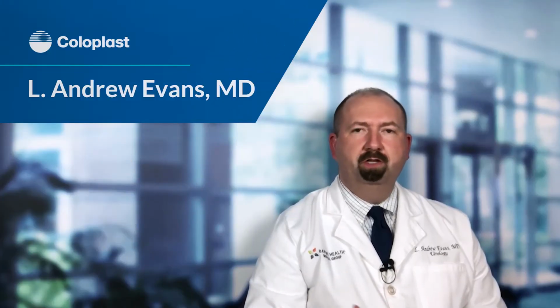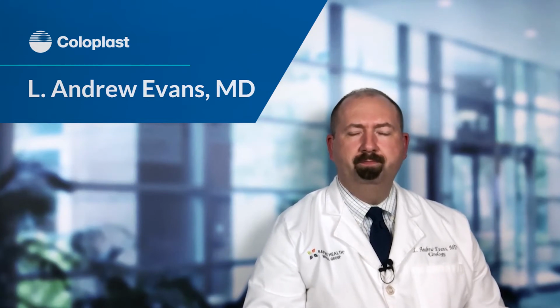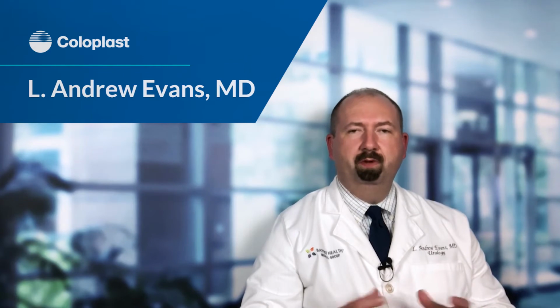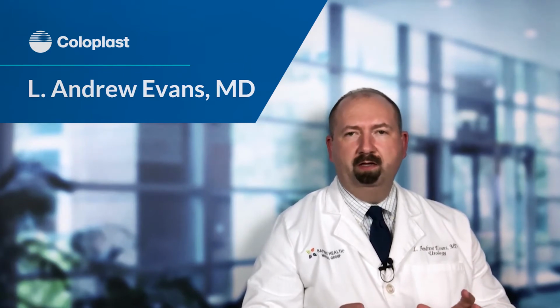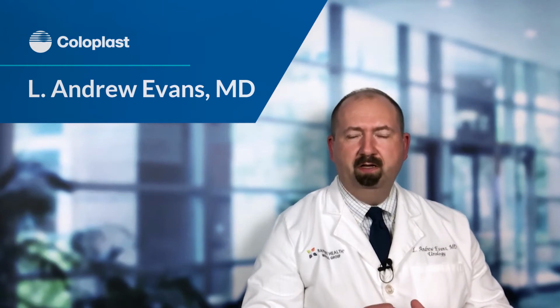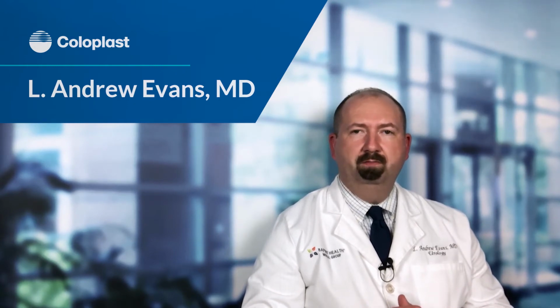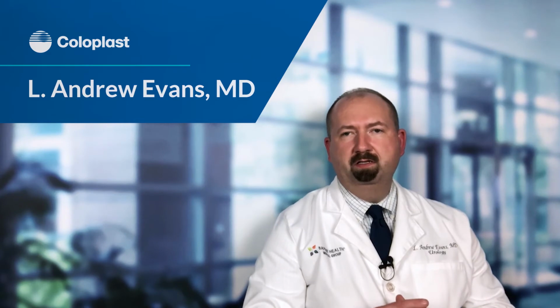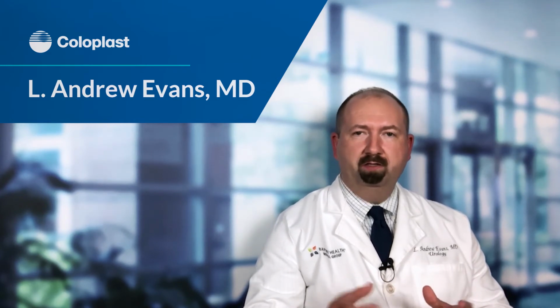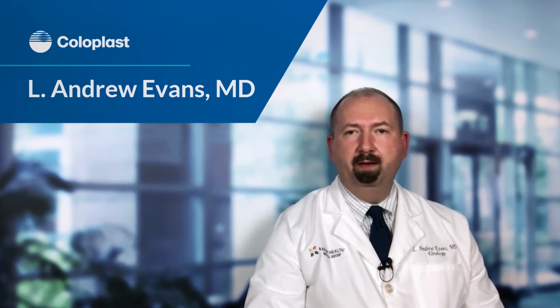All male slings are generally made of polypropylene mesh. This is a very safe type of mesh that we've been using for many years, and if placed correctly, has a very, very low risk of side effects. It's important to know that this is totally different than some of the other bad press that some of the vaginal mesh products has received in the lay media.